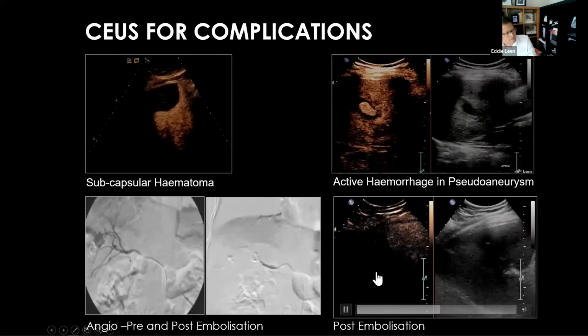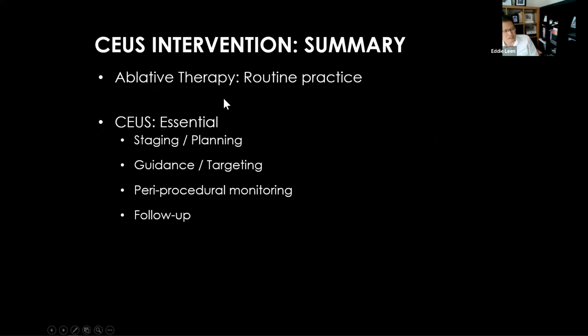So in summary, ablative therapy, as we know, is now routine practice in most teaching hospitals. And what we know is that CEUS is an essential tool in the staging process, the guidance, and the periprocedural monitoring, as well as the follow-up of liver cancer patients.